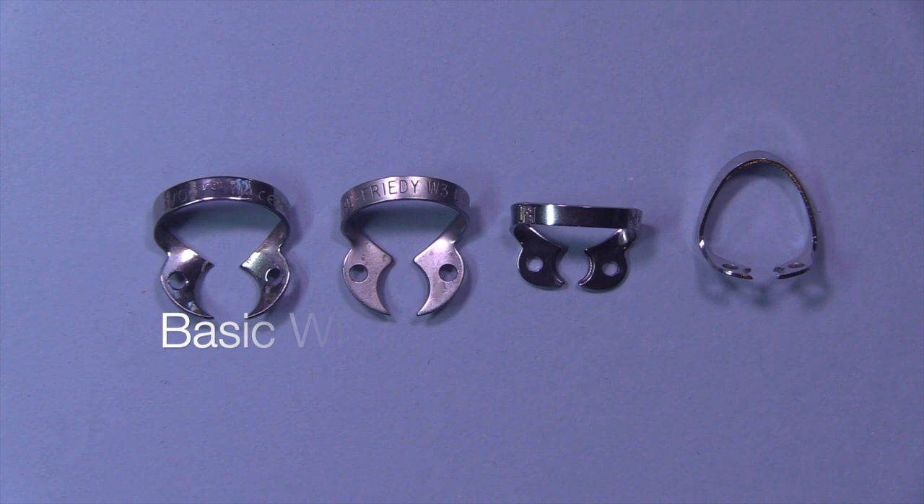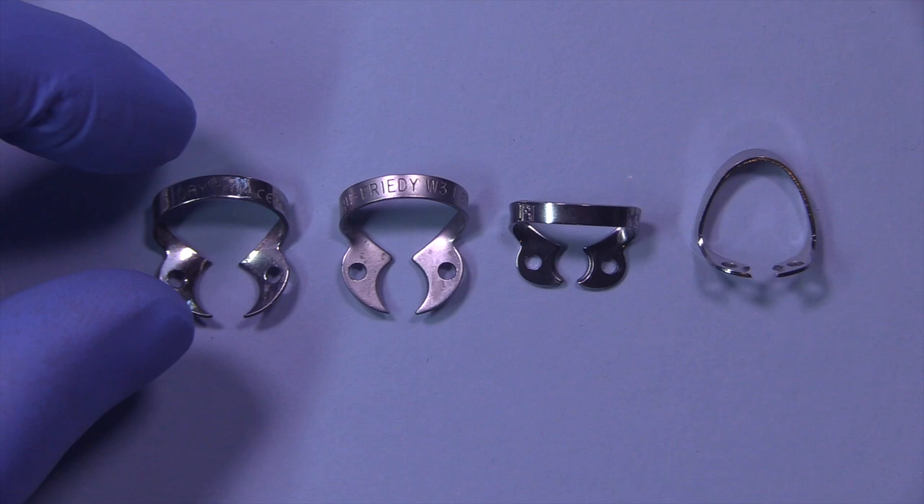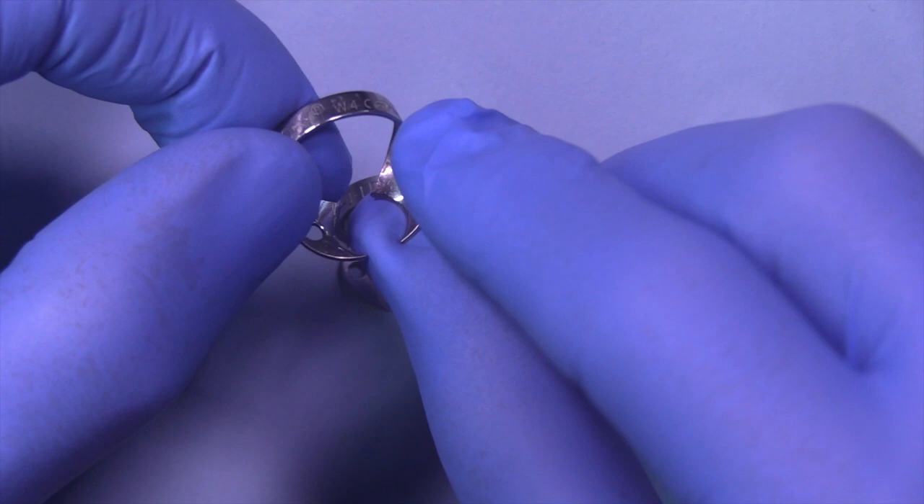Let's take a look at some of the clamps that are available. These are all my basic wingless clamp set. The first one on the far left is called a W4 and this would be used for all molars, whether they're maxillary or mandibular. It's the largest of the series and you'll notice that the wings are flat.